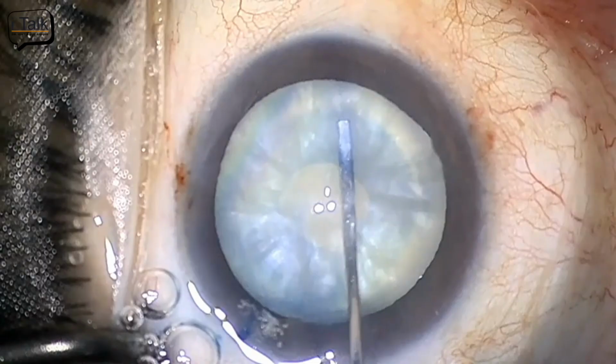Now two things need to be taken care of. The first is the intralenticular pressure, which is peripheral to the central small mini rhexis which I have created. And the second is the posterior compartment, which is posterior to the central nucleus, that has to be taken care of. Now, for this, I use two maneuvers, one of which is the one which Chi has taught us, that I'm milking it.